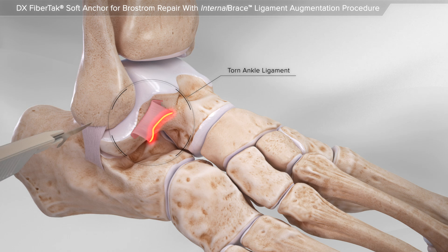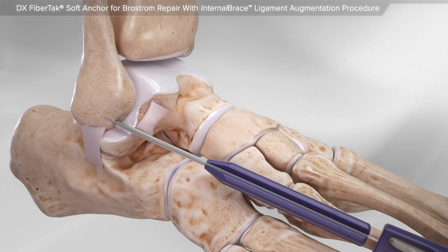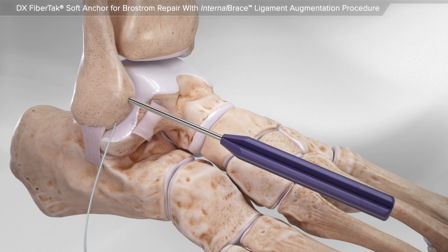Your surgeon makes an incision on the outside of the ankle over the torn ligament. Using special instruments, a suture anchor is placed into the bone. Next, a second suture anchor is placed.